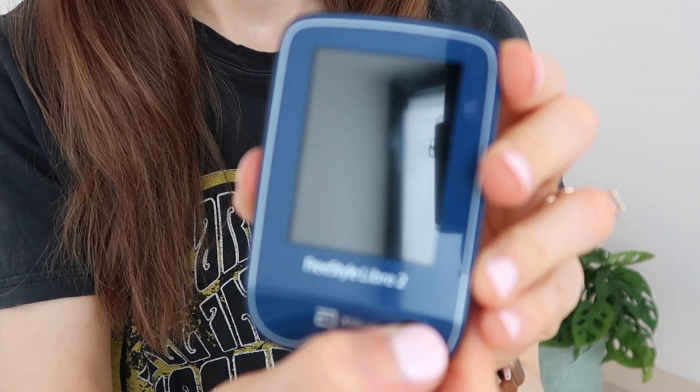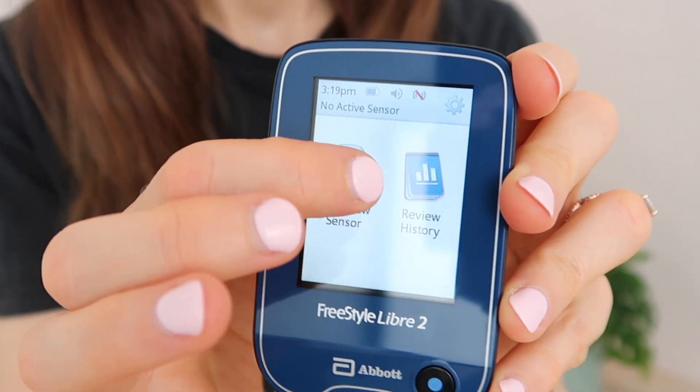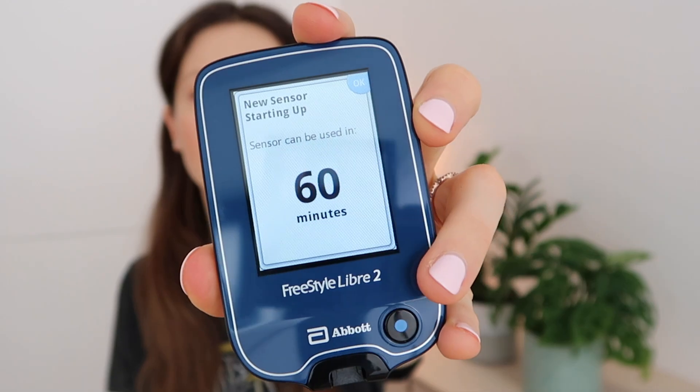Now let's initiate the warmup process. I think we're ready to make our first scan. I'm going to go ahead and wake it up, press start, new sensor. So clearly this sensor has a 60-minute warmup, which I believe was the same as the first one. I'll set my alarm for one hour from now. It looks like I will check in with you guys in roughly 60 minutes for our first scan.